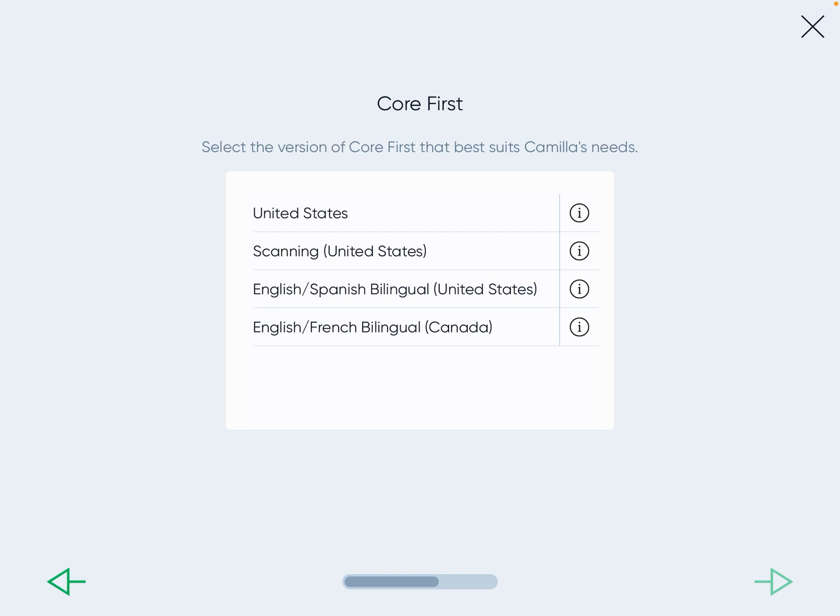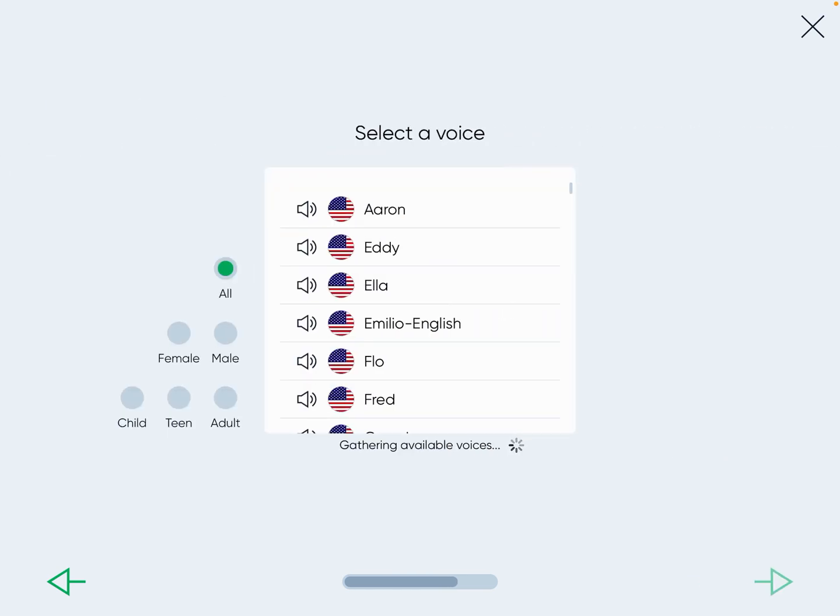What's nice is they set it all up for you and give you multiple grid sizes or buttons-per-page options, which makes it really robust. I'm going to choose English-Spanish bilingual and press the next arrow.